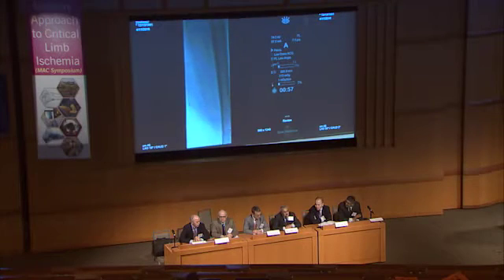It's still my conviction that after a prolonged definitive pre-dilatation with a 5 or 6 millimeter balloon, we could much better evaluate the size of the fistulas and the grade of stealing from these fistulas, to decide if we have to cover with a long Viabahn or something else, or we could remain on conservative treatment with atherectomy or drug-eluting balloons alone.